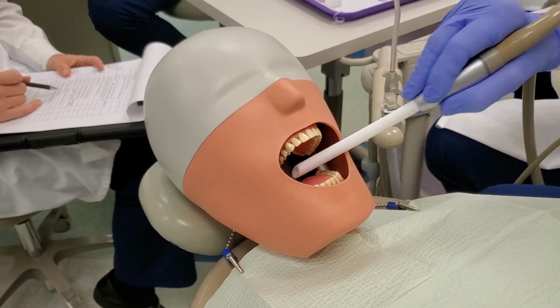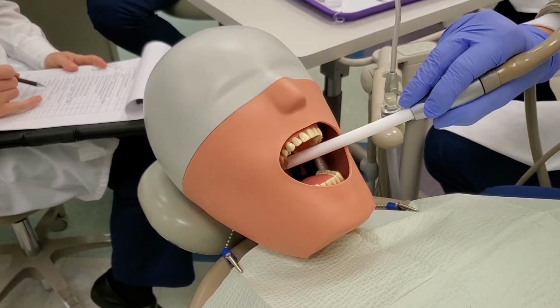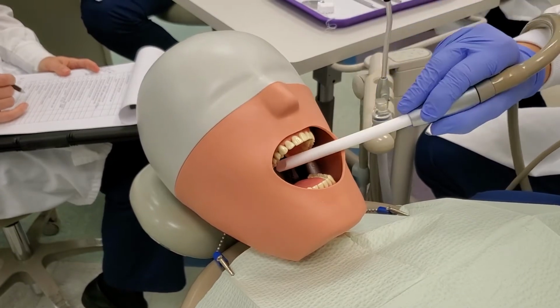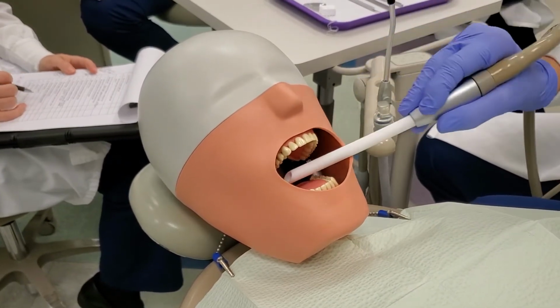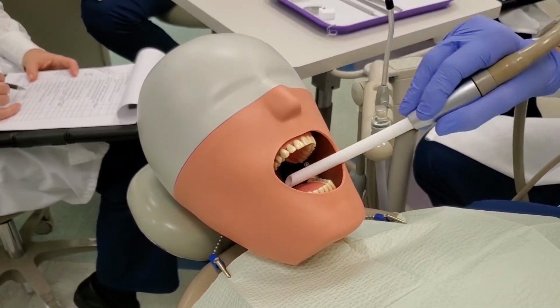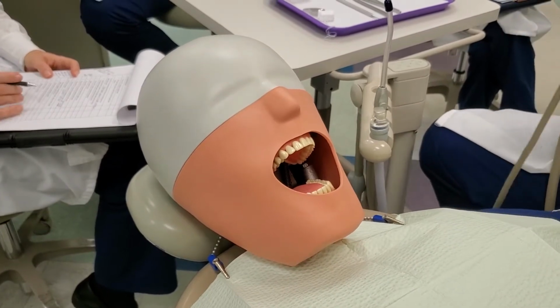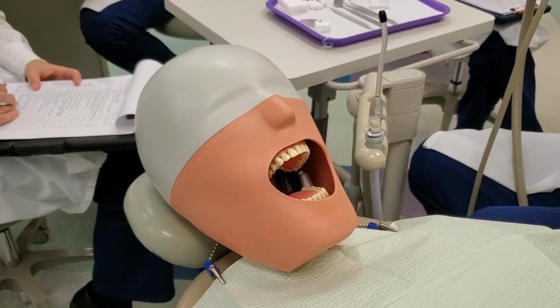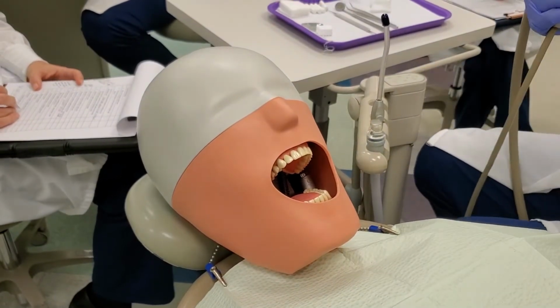So the water's going down there, it's pooling down here. So in addition to keeping this dry while we're rinsing that tooth, you're going to have to come down. If there's any pooling water, you need to get in the habit of making sure that you're clearing that out. Because you don't want the patient to choke, have to sit up, everything's contaminated now. So you're trying to keep everything nice and neat.